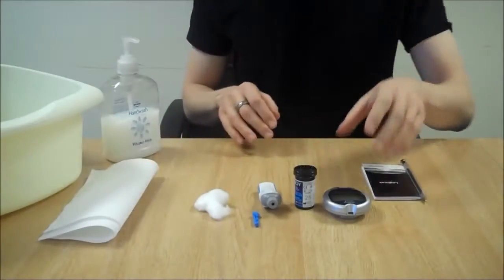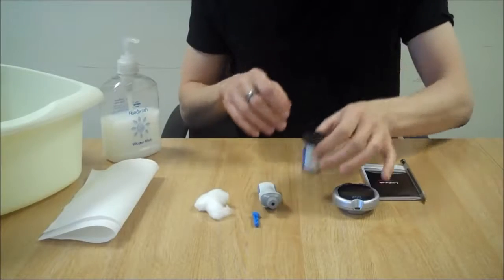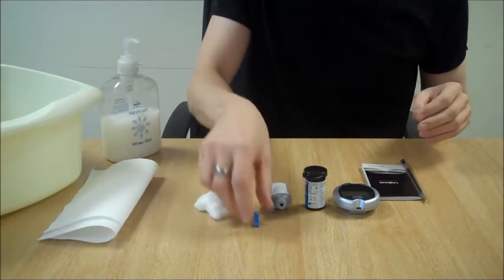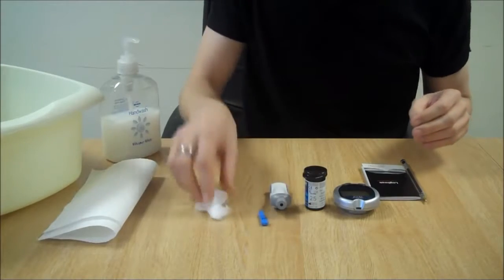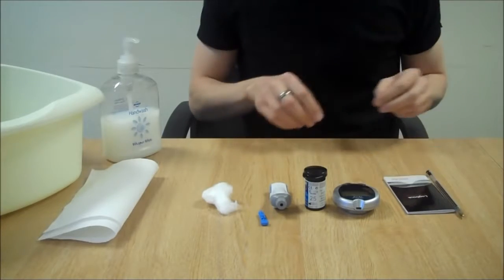Step 1: Prepare your kit. You will need a meter, test strips, a finger pricker or lancing device, a lancet, cotton wool, and a monitoring diary to record the results.